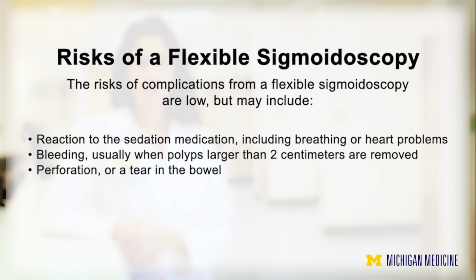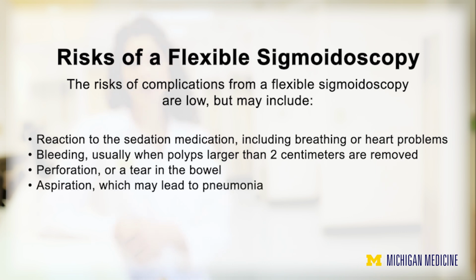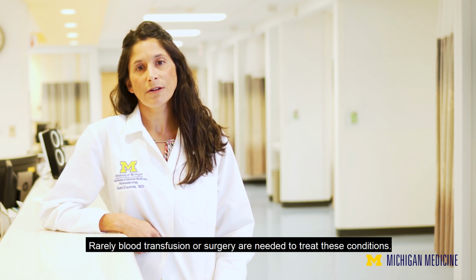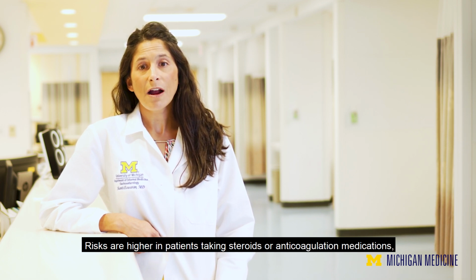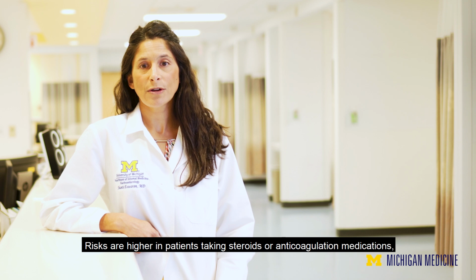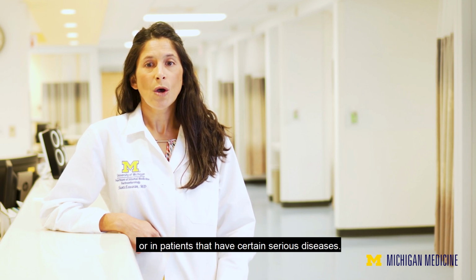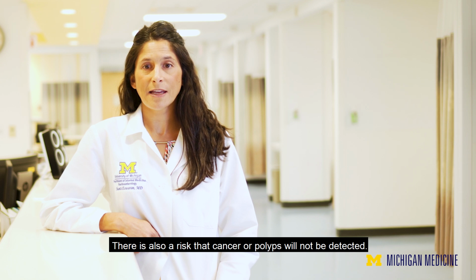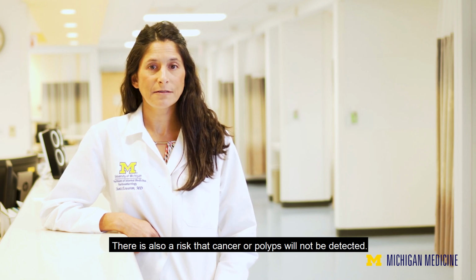Perforation, which is a tear or hole in the wall of the colon or rectum. Aspiration, which is where stomach contents get into the lungs, which may lead to a lung infection, also called pneumonia. And finally, infection, which is rare. Rarely, blood transfusion or surgery are needed to treat these conditions. Risks are higher in patients taking steroids or anticoagulation medications, or in patients that have certain serious diseases. There is also a risk that cancer or polyps will not be detected.